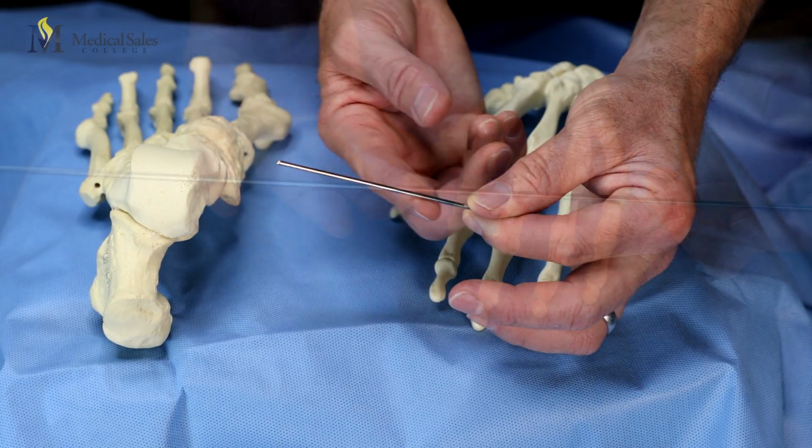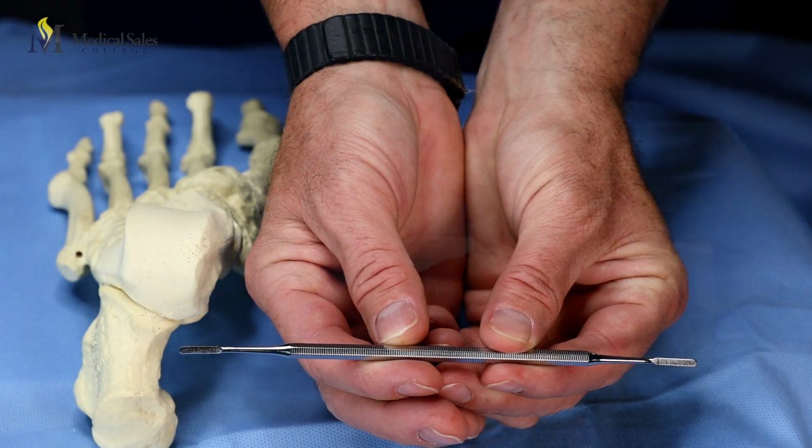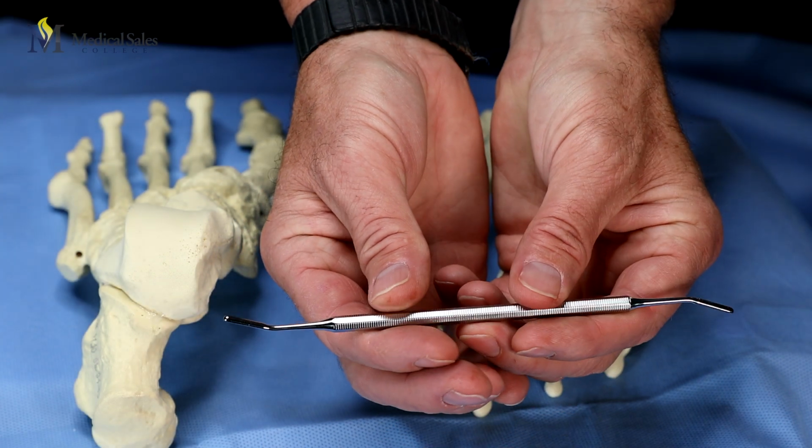This can involve K-wires or Steinmann pins. Arthroscopy probes are used inside of joints to help delineate certain parts of the joint or gently retract certain aspects of the inside of a joint. And lastly, we'll talk about rasps and files.